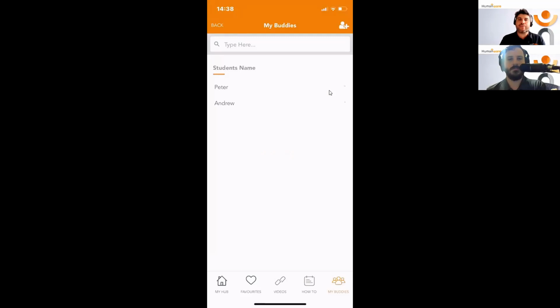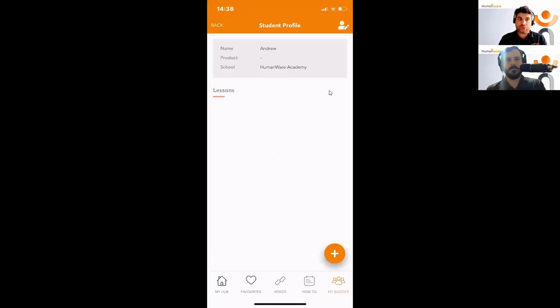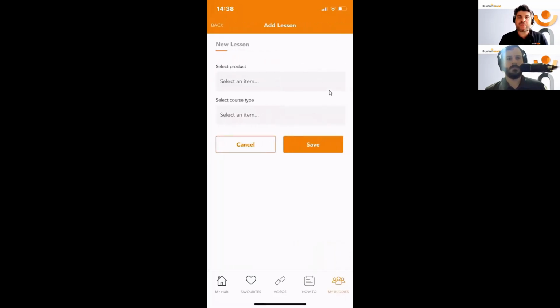And let's say today I'm visiting Andrew, and Andrew has the BrailleNote Touch. He's just received it. So I've got no lessons scheduled at this point. I've clicked on Andrew and it opens up my lessons. And at the moment, there are no lessons that are active. So I'm going to press on the plus button at the very bottom here to add a lesson. And it will take me to some options.